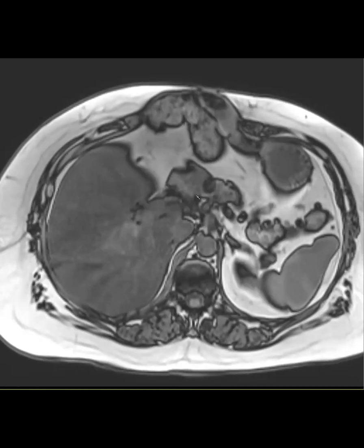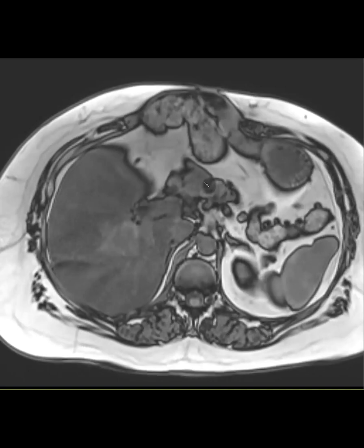The reason that clear cell RCC has intravoxel fat is because it can be very glycogen rich. So it has lipid within the cells. And then I also found this article interesting. Let's see if I can pull it over. Oh, I lost the article.